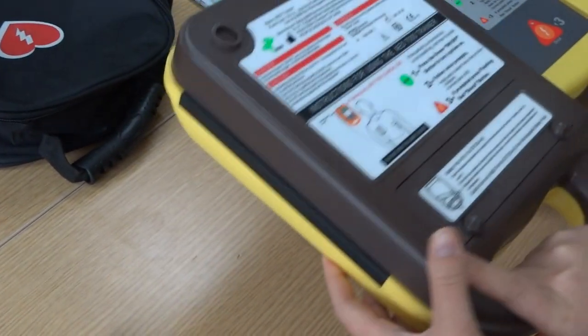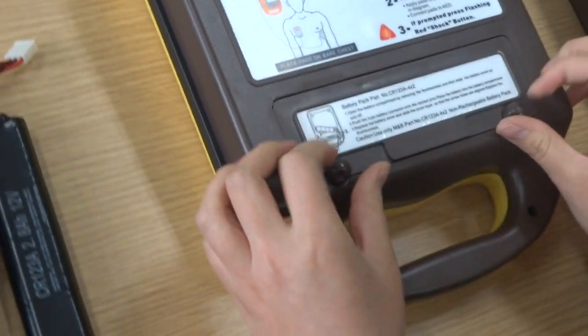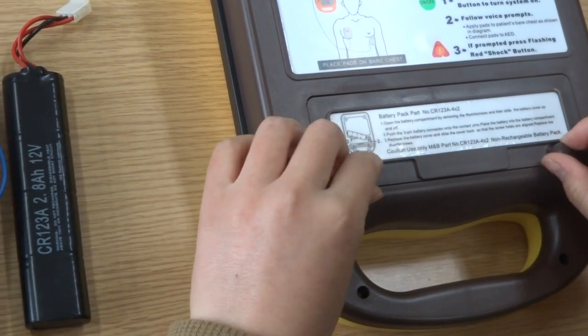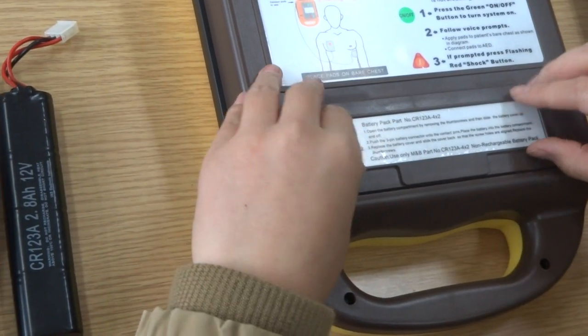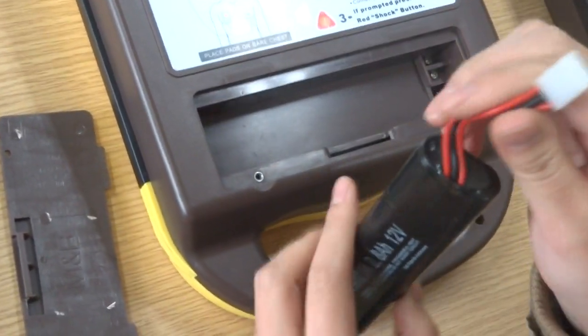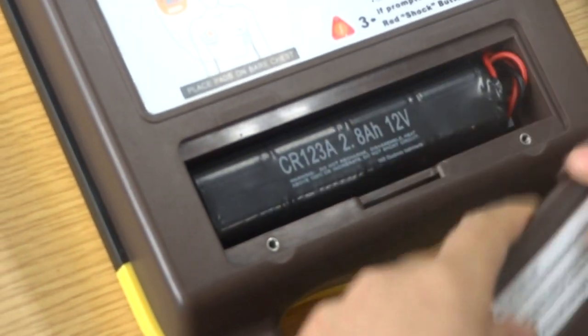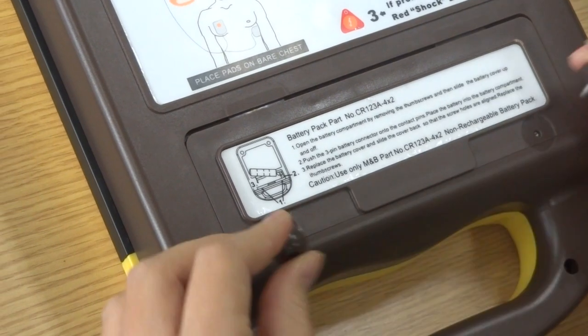First, install the battery. Open the back cover of the battery compartment, insert the battery, and close the cover. Then tighten the two screws.